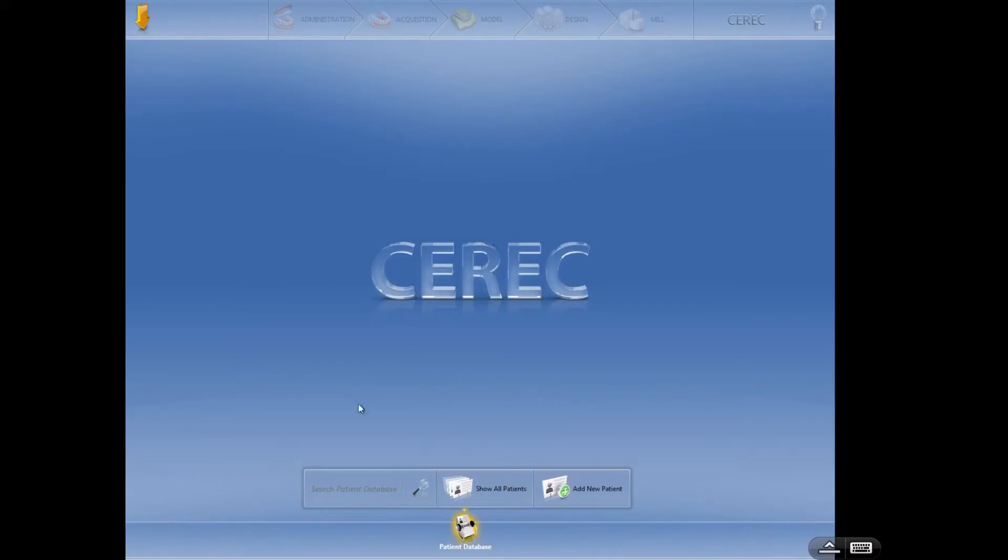From this screen I'm going to add a new patient. Now if we had a patient who had already been seen in the office, you can certainly start typing their name in here and search for it. But I'm going to add a new patient.